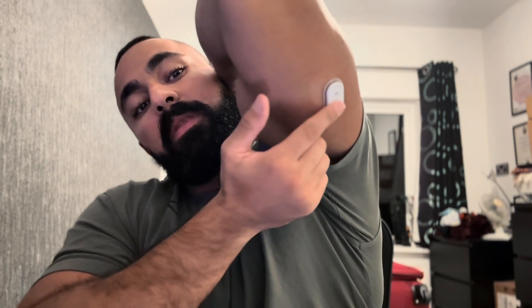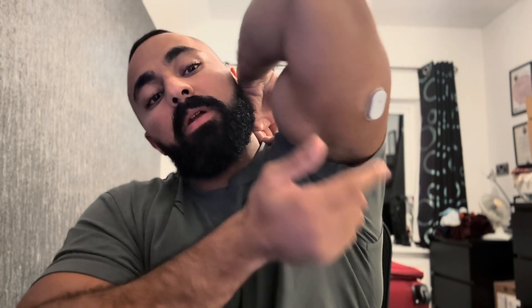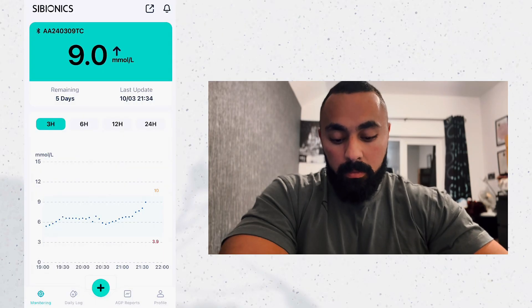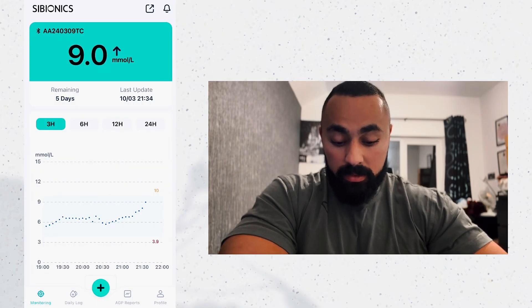Hey guys, today we're going to go through the Cybeonics app. I'm going to open the app and go through every single feature to show you exactly what it does and why it's different from other CGMs. Cybeonics is a CGM — I'm wearing one right here. I already made a video unboxing it and showing you how to wear it, so go back and have a look at that. Now let's open the app.